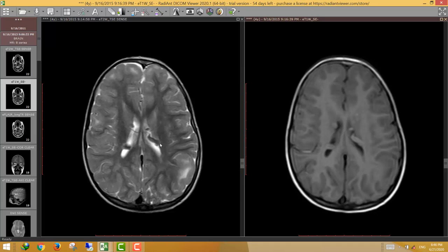If the nodule size increases beyond 1.3 cm, this is suspicious and may indicate neoplastic transformation. This nodule is large with a diameter of 1.4 cm, so it is suspicious and may indicate a subependymal giant cell astrocytoma.